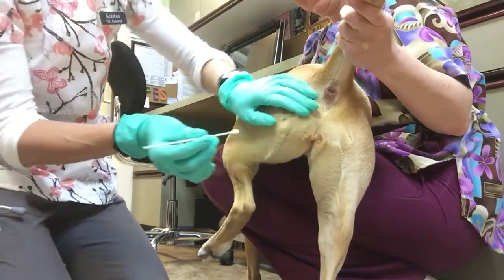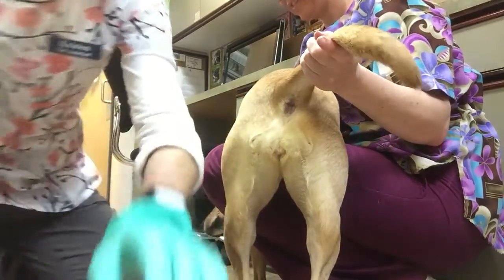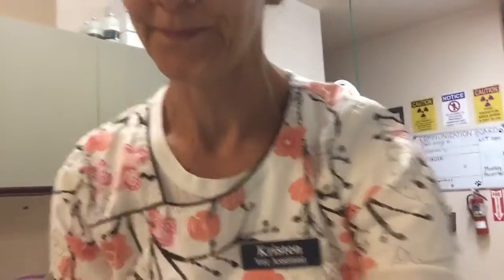It's okay, baby. It's okay. Good job. Okay, good job, Lua. Okay, got a swab from Lua. She was not so happy about that. But she's doing okay. Thank you, Chris.